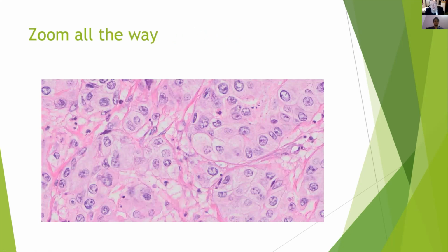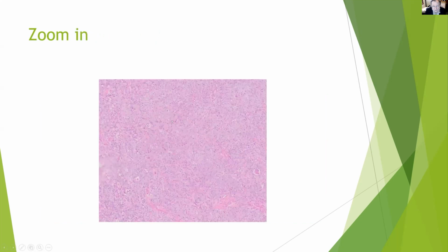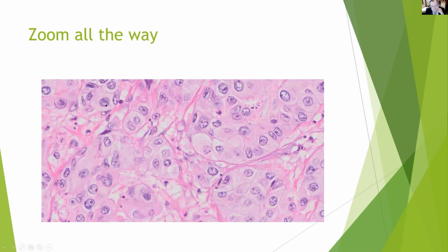In other words, you are out of the journal, so to speak. You are into a location. You have access to not a picture, not a fixed image. So here's the pathology, but you have the slide itself. So you, the viewer, the physician reading the article, can see the slide, can look at it at different levels, all the way from the whole totality of the slide down to the nuclear level, and make your determination for whatever reason as a professional you would wish to look at that. And you have that capability based on the skills that you learned in the lab, such as I'm describing, to show you how to do all of these things.